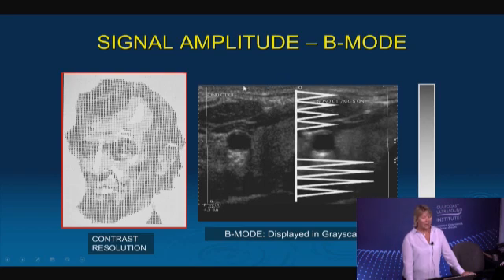And so from here to the top wall of the carotid, all of this structure is all muscle, same density and stiffness. So when we look at the spikes, they're all the same peak, all the same height. Then the sound keeps traveling through, and it then interacts with the carotid artery, which is fluid-filled, a different density and stiffness. In fact, fluid-filled structures are very weak reflectors.